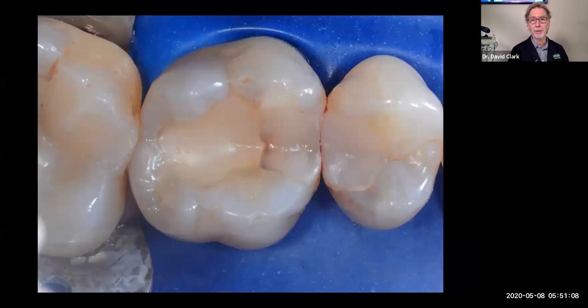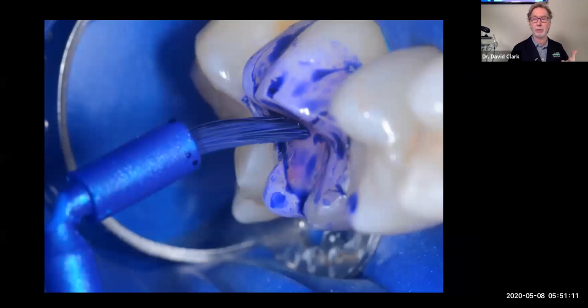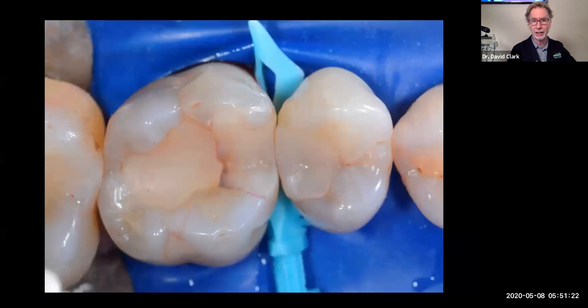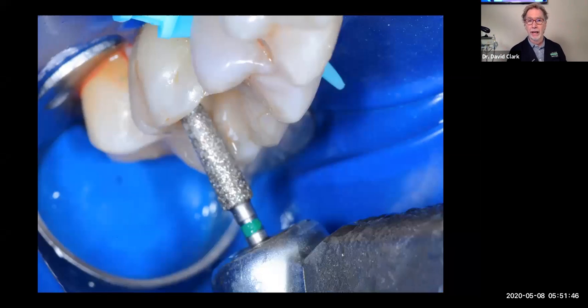So here we are preoperatively, so let's go through the sequence that we always use. The first thing we do on every single tooth is disclose. We put the disclosing solution on the tooth. There we see, it helps us to identify where the biofilm is, and we can also identify cracks in the tooth. So there we are. We pre-wedge every single time. The pre-wedge is part of the modern class 2. If we don't pre-wedge, we can't do the Bioclear method because it pushes the soft tissue out of the way. And by the time you do your class 2, you've got 3 millimeters of composite tooth interface that used to be covered with gums. That protects your rubber dam.